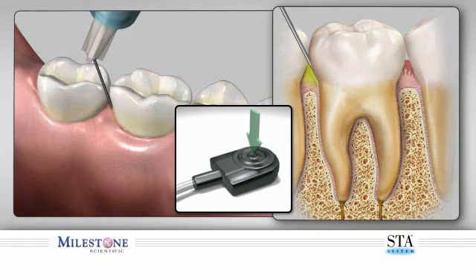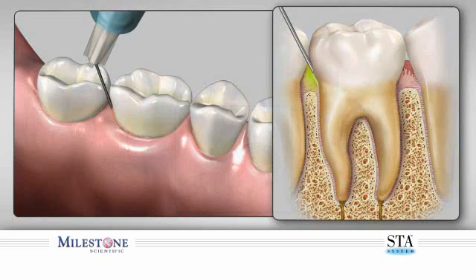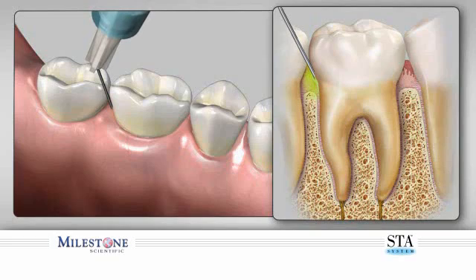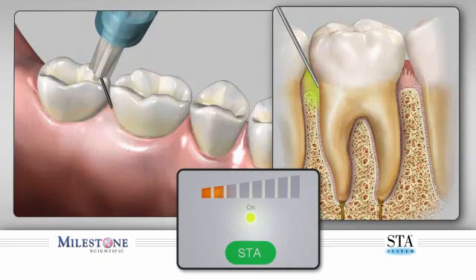The control flow rate is initiated by depressing the foot control, and after three audible beeps, you will hear the unit announce 'cruise.' Once you hear the word 'cruise' spoken, you may remove your foot, and the STA system will continue the flow of anesthetic solution until you depress and release the foot control again to stop the flow.